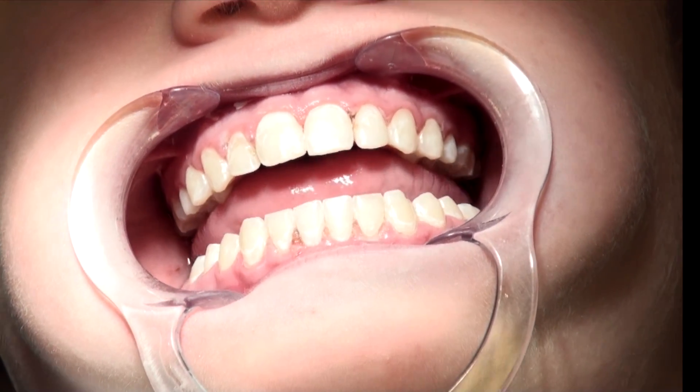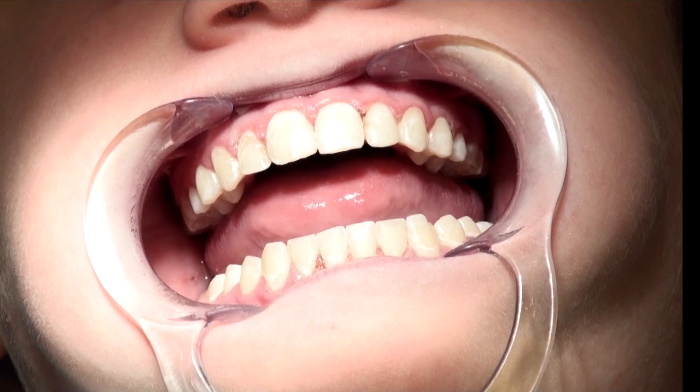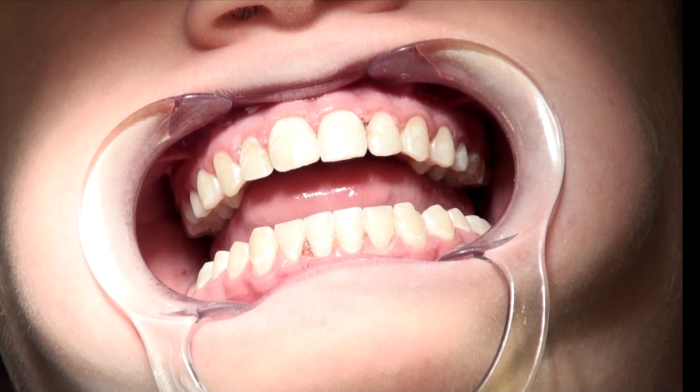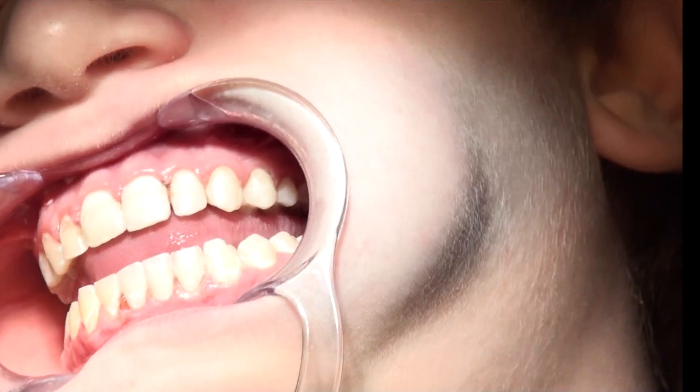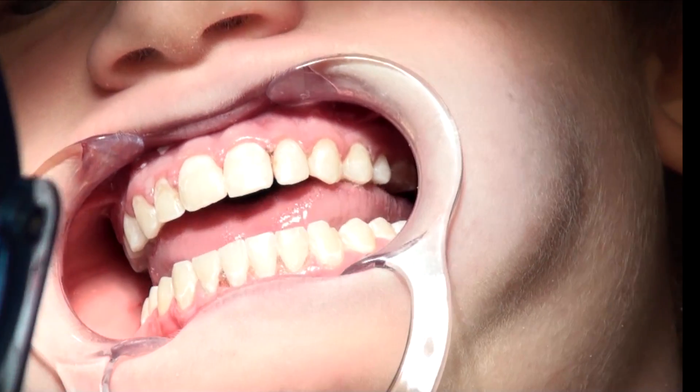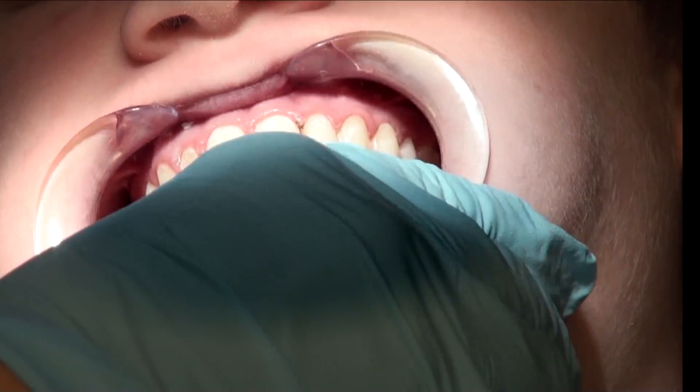Jason had most of his white lesions treated today, and we can see a really great significant difference. Jason, take a look in the mirror — tell me what you think. They look terrific. Thank you so much.